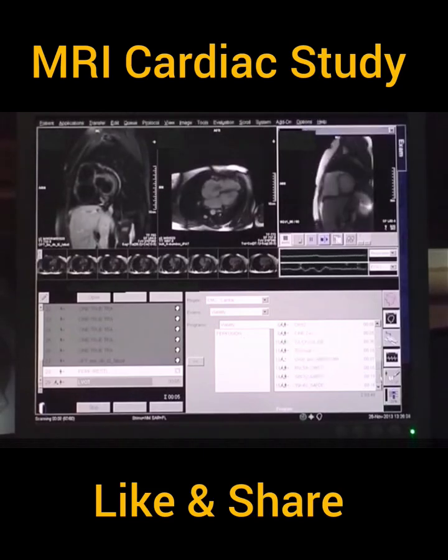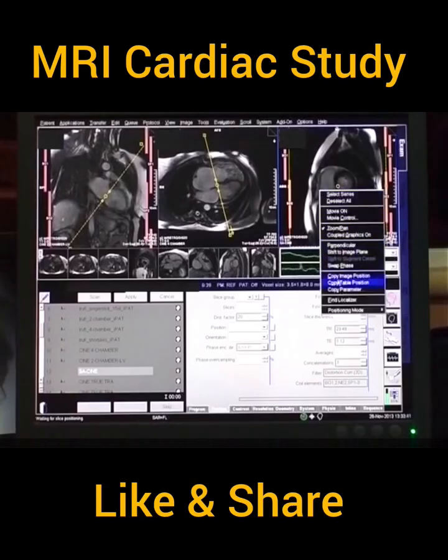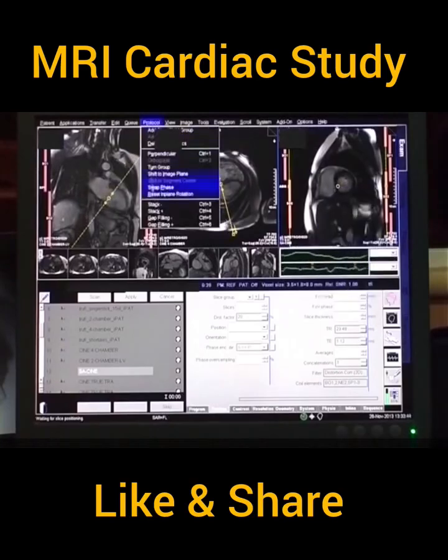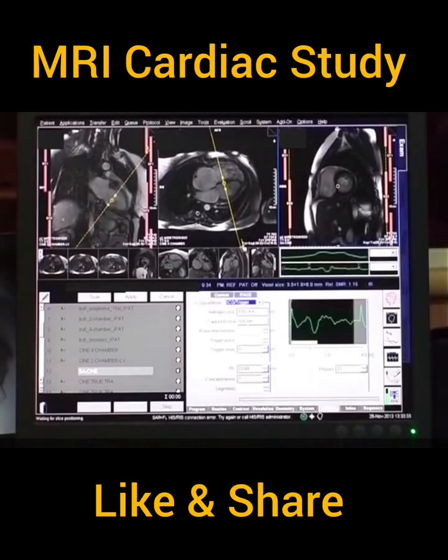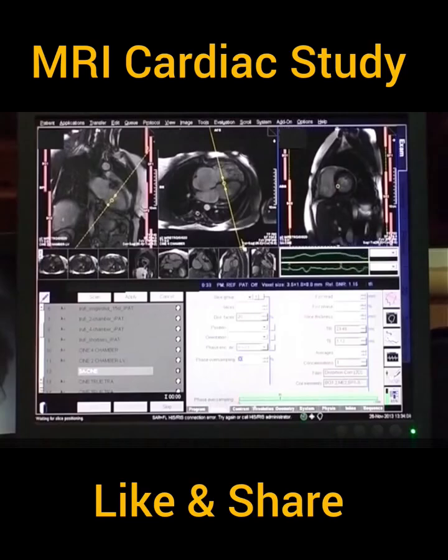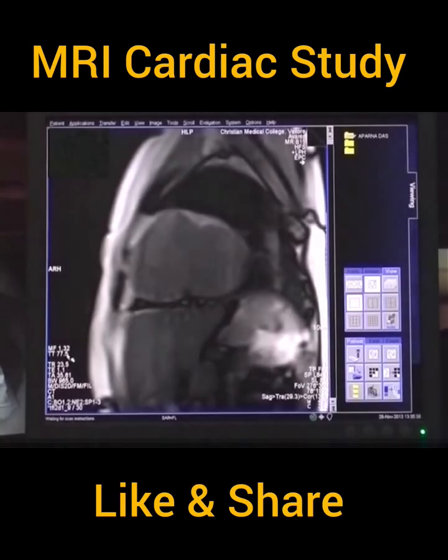Following this, a delayed hyperenhancement scan is done 10 minutes after the injection of gadolinium. A time of inversion scan is obtained. A single midline short axis image is taken. And a series of different time of inversion images are acquired. Initially, the myocardium and blood are bright.